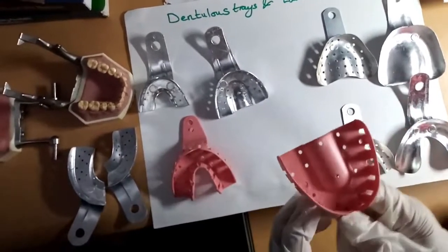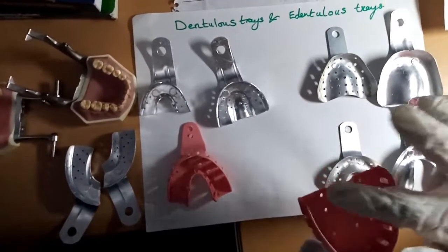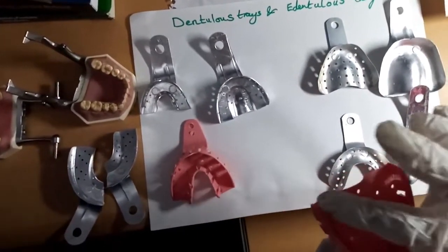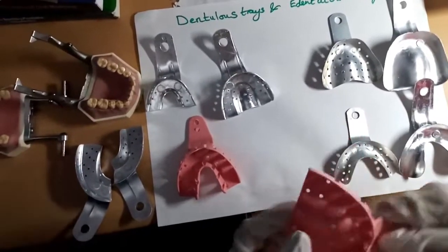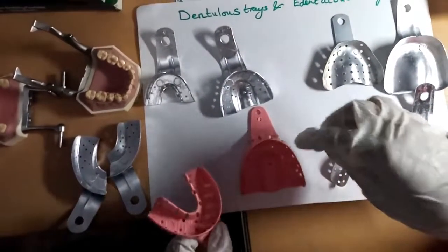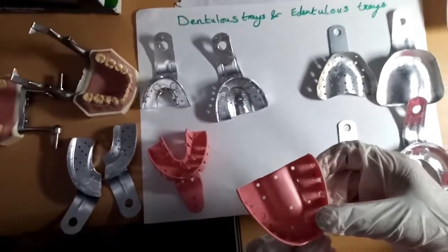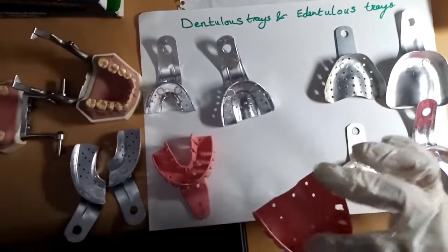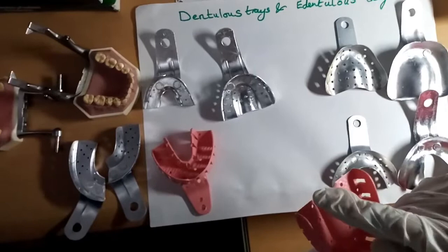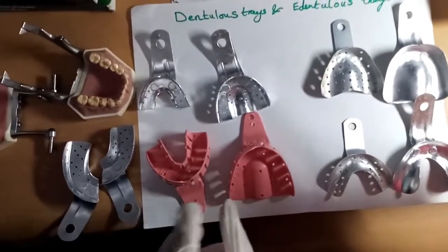Let's talk about the maxillary impression tray. We record the palate by the palatal vault. This is the palatal vault, okay, so it's made to record the palate. And this is the upper; then we'll talk about the lower. The upper maxillary impression tray is used to record the teeth also, okay? So we record the teeth and the palate by using the palatal vault, and the flange, which we call the flange area.